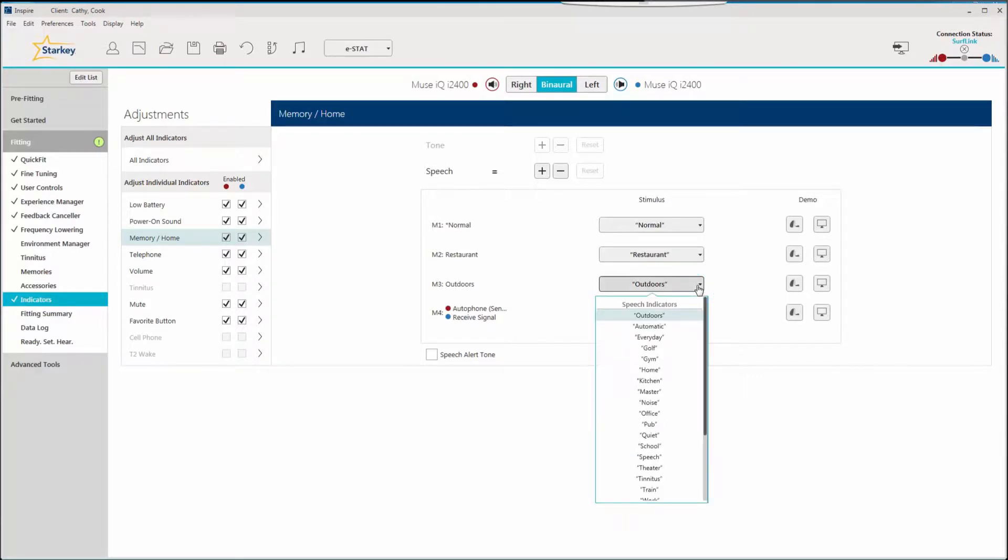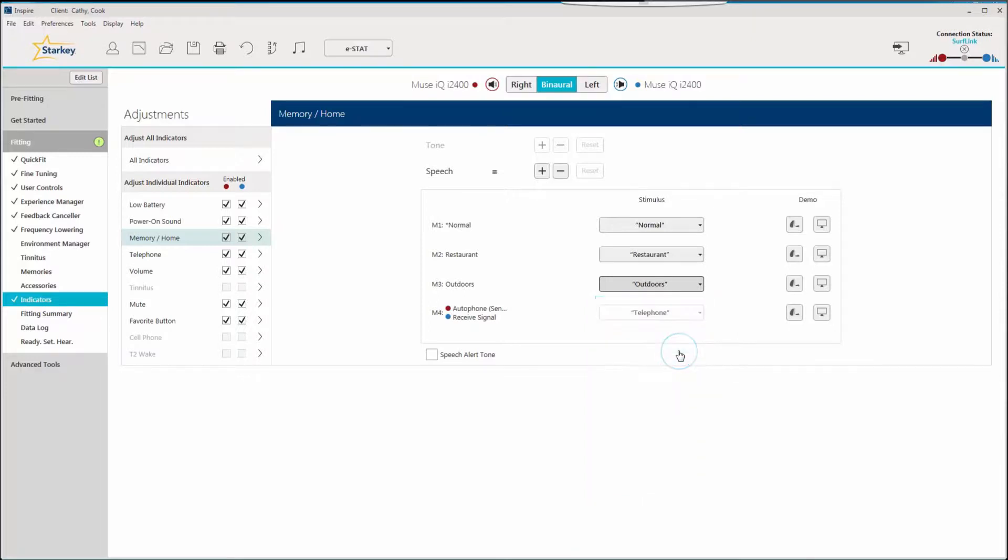Let's say the outdoors memory created is actually intended to be used for golfing. This memory can be further personalized by clicking on golf. Once set, the patient will hear 'golf' whenever switching into their outdoors memory.